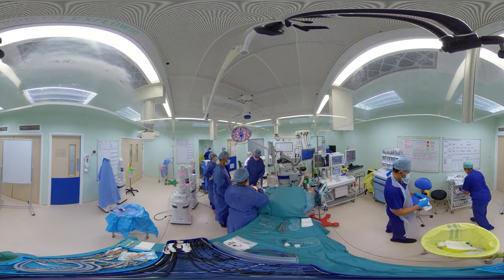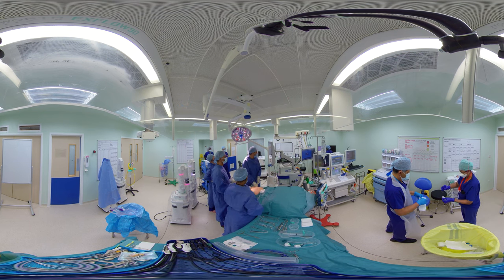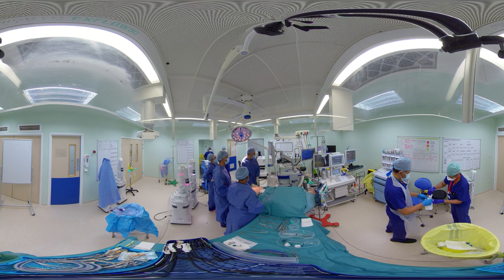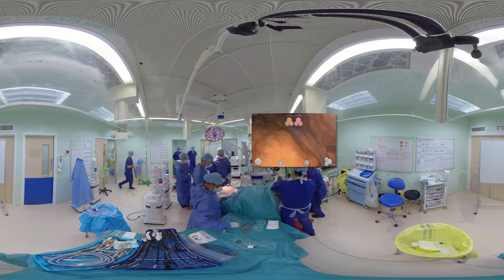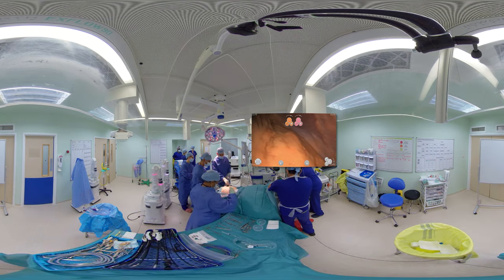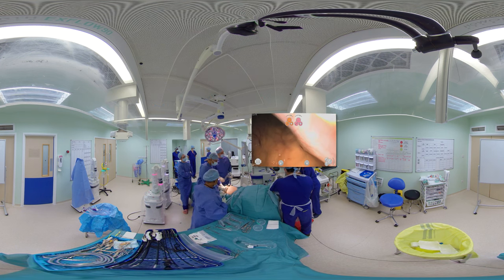Once the patient has been prepped and draped, we insert the laparoscopic ports. We use standard ports, inserting an 11mm port at the umbilicus, followed by a further 11mm at the epigastrium and two 5mm ports in the right upper quadrant.